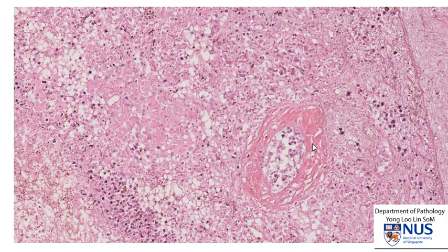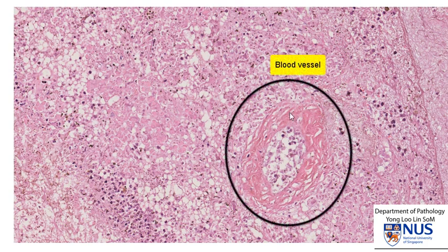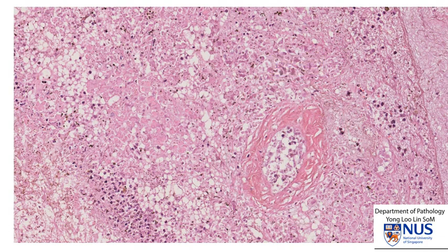Here is an even higher magnification view showing all the necrotic digested tissue. This is a blood vessel where the wall has been destroyed, and there is some evidence of fibrinoid necrosis. This explains why we see hemorrhage grossly, because the blood vessel walls lose their integrity.